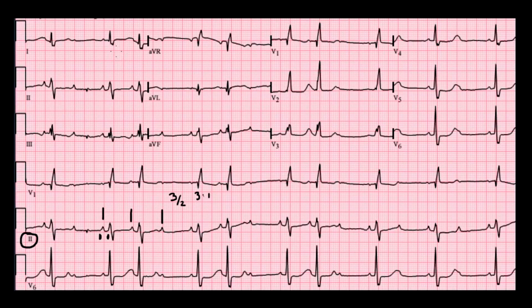If we look over here, you can see here's a QRS complex, the same one, and a P wave there. That's less than a box. So to me, when I'm looking at all of these, they look pretty much about the same in this situation too: we have a PR interval that's not getting any longer and it's less than 0.2. So that to me makes me think that this is actually a Mobitz type 2 or non-Wenckebach second-degree AV block. What was the other characteristic?